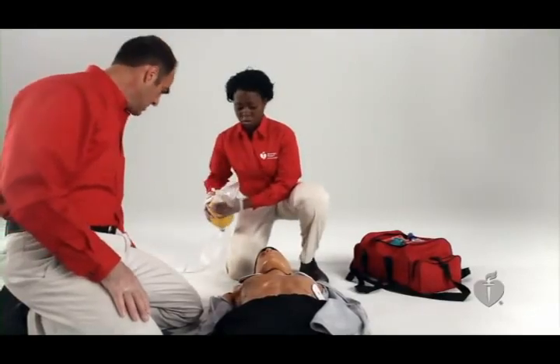Clear now. Be sure that no one is touching the victim, not even the person in charge of giving breaths. Ideally, you will pause CPR during or immediately after a set of compressions. Some AEDs will tell you to push a button to allow the AED to analyze the heart rhythm. Others will do that automatically.